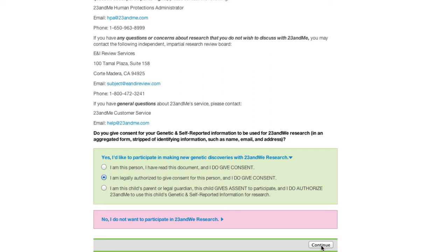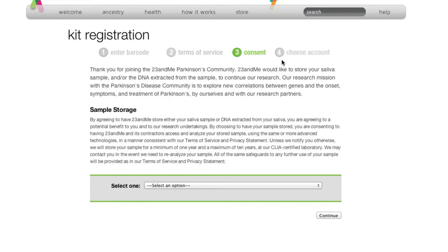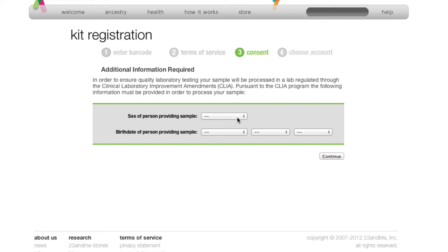Yes, I will participate in research for the sake of the betterment of humanity. And for sample storage — what sample storage does is they can hold it for a minimum of one year and a maximum of 10 years, wherein when new genomes are sequenced, they can go back to your sample and reanalyze it to expand upon the current database of information about your genome, because obviously the whole genome isn't fully sequenced yet, and as new information comes up they'll be able to go back and look at it.